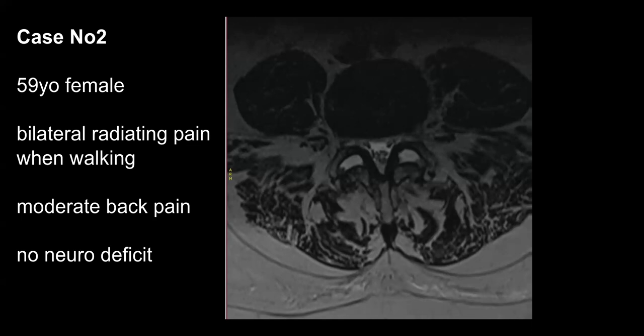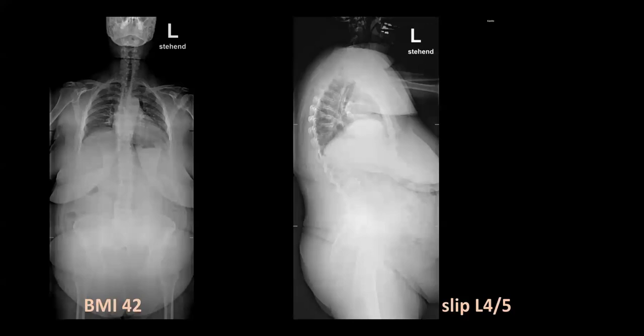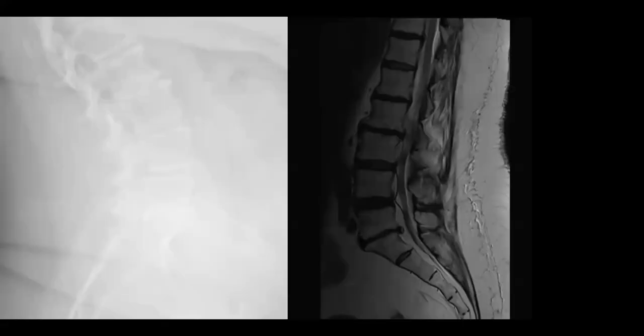Look, I think in the presence of that degree of motion between L4 and L5, a ReActivate here would be challenging to get to work. Probably not the ideal patient as well, with, I think you said, some features of radiculopathy going below the knee. We tend to avoid ReActivate for those cases.